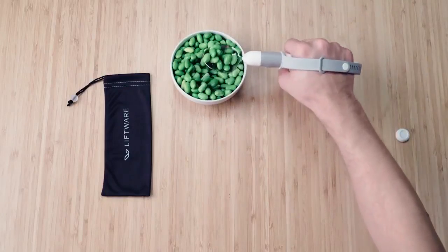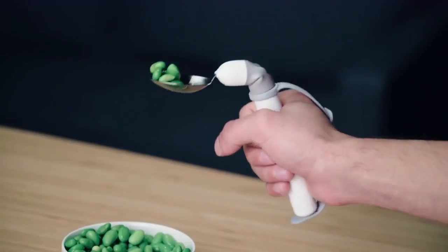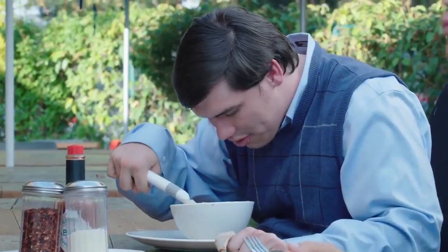The Liftware Level is an electronic handle that recognizes what position your hand is in at all times and works to counteract any unwanted movements, so that you can relax and enjoy the company of those around you instead of worrying about the task at hand.